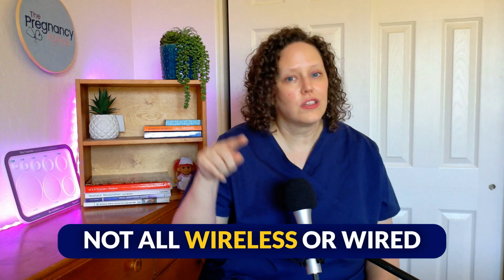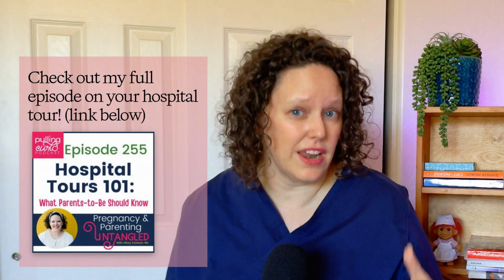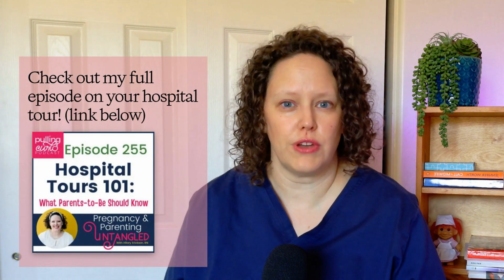Now here's a quick caveat. Not all wireless or wired monitors are waterproof, although most facilities probably have waterproof monitors. So you'll want to check with your facility about ones that can go in the shower or the tub. Huge fan of the shower, by the way, probably more than the tub, just because getting out of a tub is tricky when you're 9 months pregnant. But talk with your unit. This is a great thing to ask on your upcoming hospital tour. And in fact, I have a whole podcast on making good use of your hospital tour, and I will put a link for that down in the show notes.